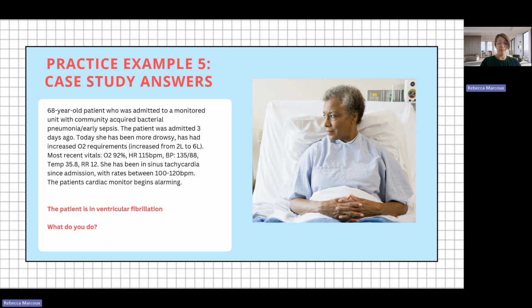So when you get the defib on, you do not need to finish your round of CPR. You can stop, defibrillate, and keep going. Depending on your facility, make sure we have, at the Ottawa Hospital and ICU, we have a medical directive to apply defibrillation ×1 without a physician present. But you do need a physician's order for this, whether this be a medical directive or the physician there to order it. So don't forget about that piece.